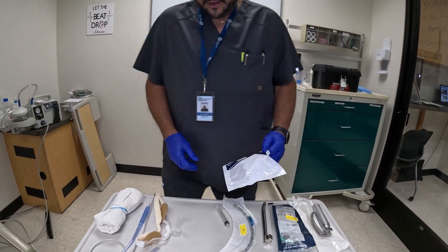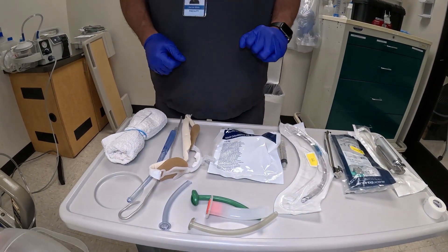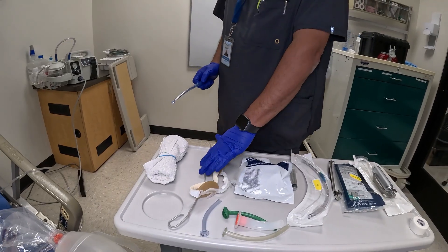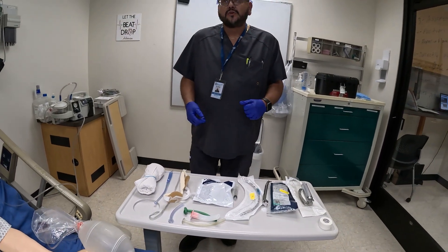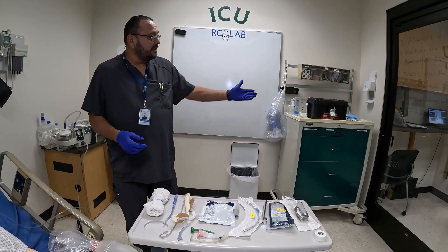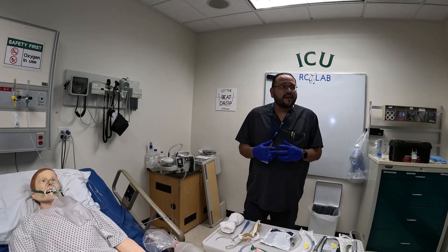I have my end-tidal detector — it's in the bag and I haven't opened it yet. You have a 10cc syringe. I have airways like OPA and NPA in a few different sizes. I have my stylet, a neck roll in case I need to support the neck, and my suction. Make sure you have anything else you think you might need at the bedside — different size ET tubes, additional stylets, your intubation box. You also want to protect your eyes, so you may need goggles or a face shield.